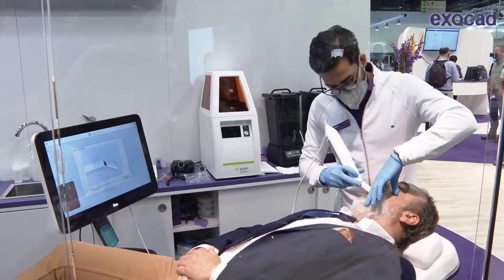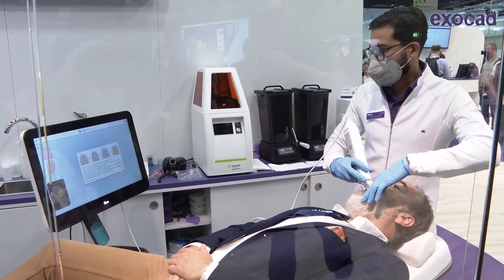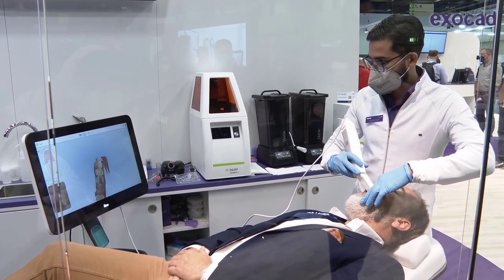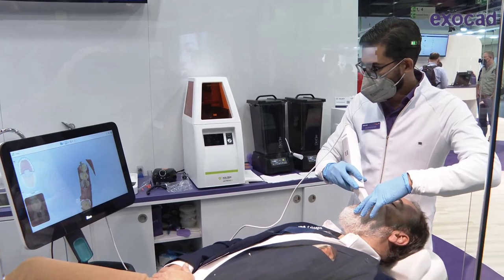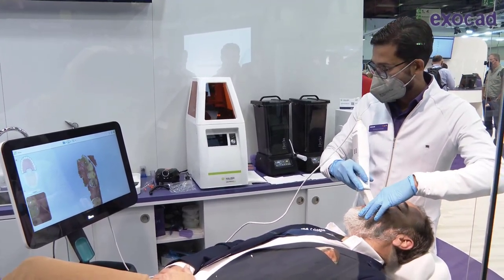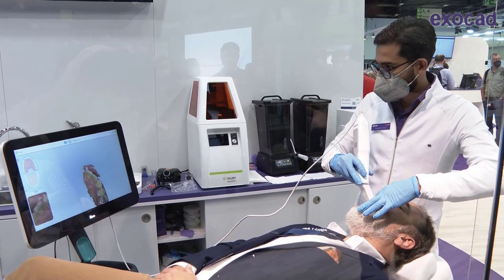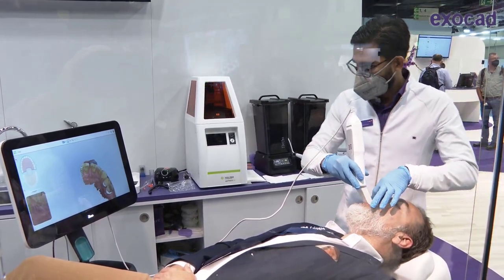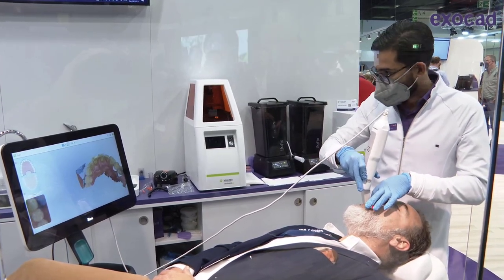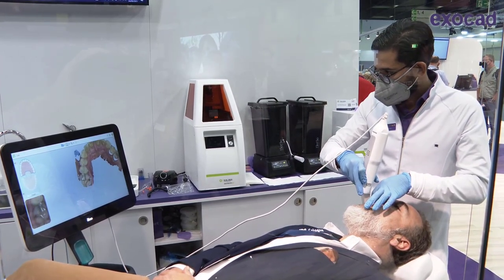Is there a specific scan path to follow? We're positioned ideally at 12 o'clock, just behind the patient, so we can look forward onto the screen. With the iTero, it's important to watch the screen. We normally start on the occlusion — taking the occlusal path first to have a reference point. We take a full arch scan; the first round doesn't have to be too perfect — we can have a few holes or gaps.